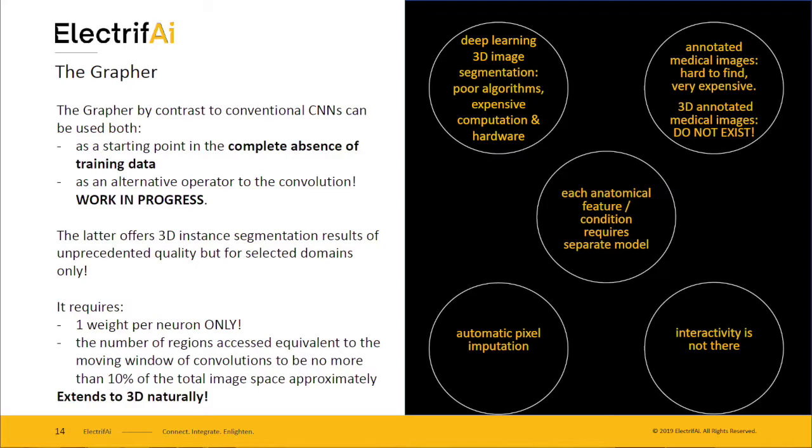And you have a different class of algorithms that use pretty much one of those slices to perform a segmentation, and then you use that as a seed into a region-growing algorithm, and then you produce the segmentation that way. And you've got also convolutions happening in 3D space, but then there is the problem of the anisotropy of data. So you don't have the same dimensions in the z-axis as you do have in the x-y.